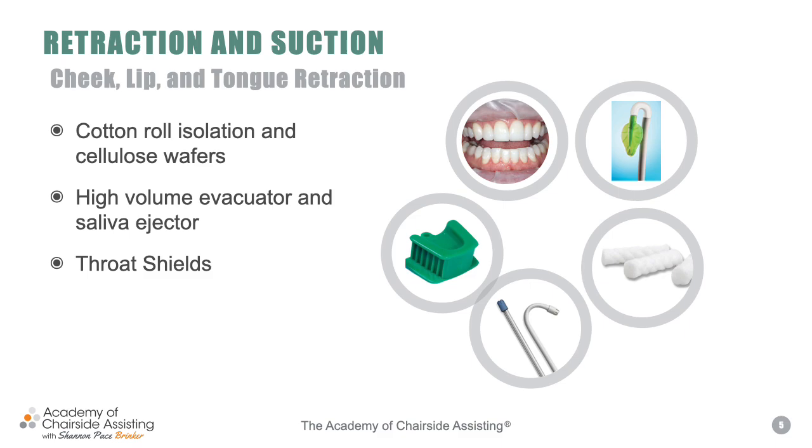And so we're going to first talk about cotton roll isolation, which is just, again, everybody's utilizing cotton rolls. Some evacuation devices as far as high volume suction and what we call our saliva ejectors, and then utilizing throat shields and mouth props. So let's get started.